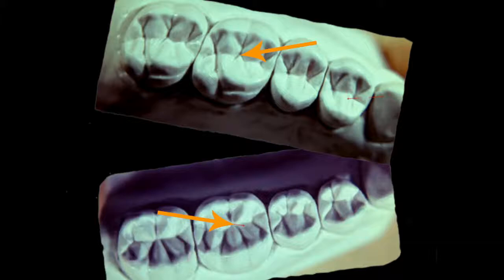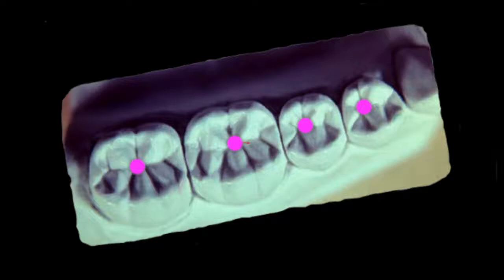Something to keep in mind is the retrusive pathway that cusps take through their opposing fossae. It is an oblique movement, not down the central groove. That statement assumes that the amount of retrusion required in each joint is approximately the same. The advantage of being able to look into the fossa of the articulator is that you can make that judgment in advance. The movement will be parallel to the midline of the mandible.